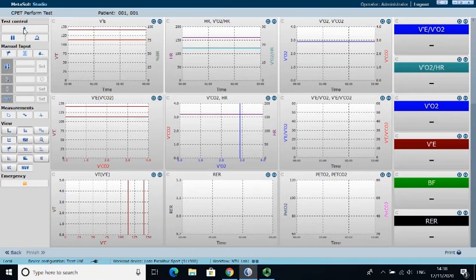And we're on the bottom left hand panel, that is VT against VE again, and what this is going to show you is the pattern of increase in respiration, so how we increase VE, whether it's due to increases in the depth of breath or the increase in the frequency of breaths. And what you're going to see is a kind of particular pattern that you get during exercise, which I'll talk about in a minute.